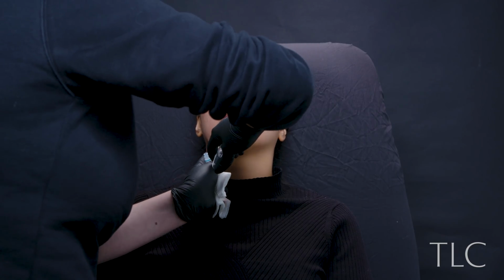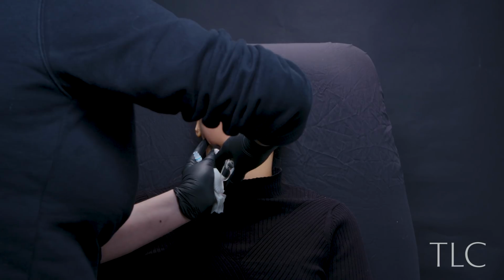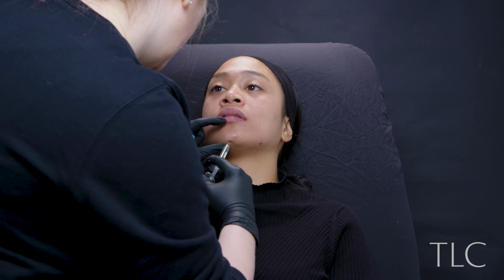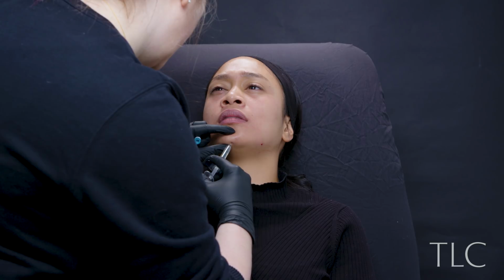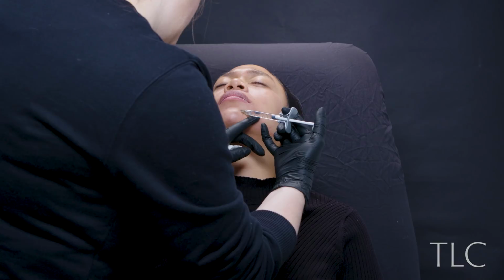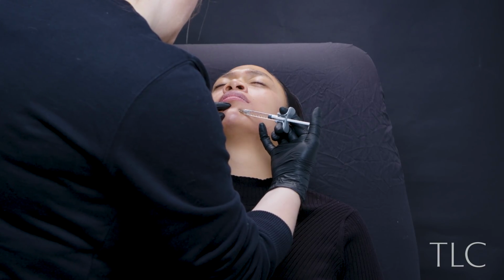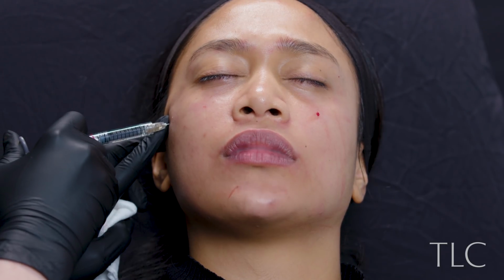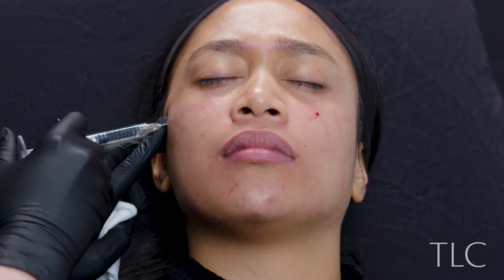The next thing that I did was some Radiesse using a cannula from the midpoint of the jaw back to the angle of the jaw, and we did 0.5 mils per side there. Then I filled the tip of the chin, and I actually used a mil of TSL Ultimate here. Then Juvederm Voluma to the front part of the cheek and also to the chin crease. I then used half a syringe of TSL Ultra Deep on each side of the cheekbone. And then we had done 4 mils.